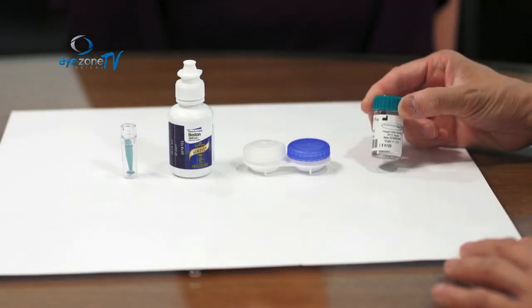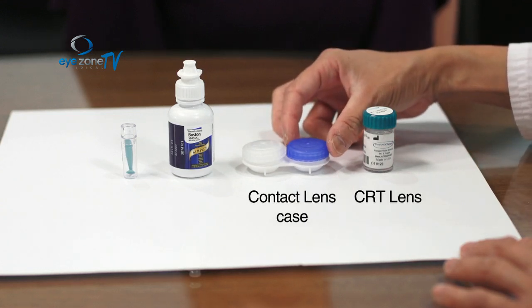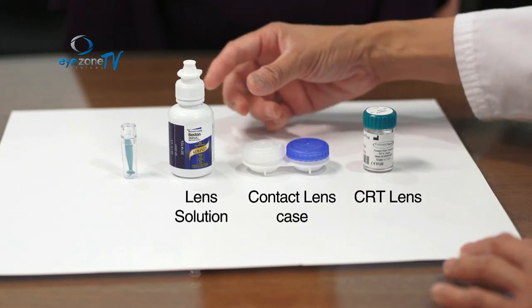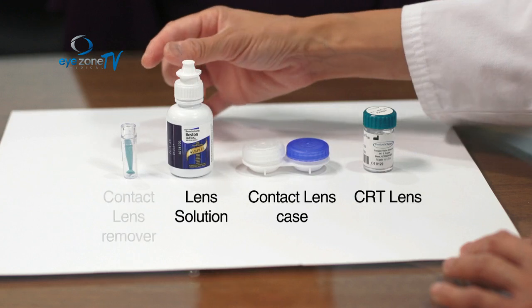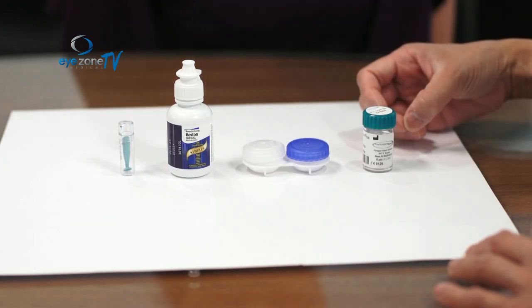Today we're going to demonstrate how to use your CRT lenses and how to take care of them. The first thing you're going to need is your CRT lens, which we've just measured you for. You're also going to need a contact lens case to store your lenses, keeping your right and left lens separate. You'll also need a solution to wash and store your contact lenses, and a small plunger to remove them from your eyes.